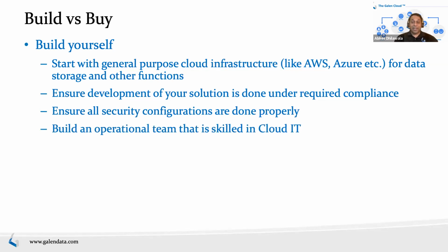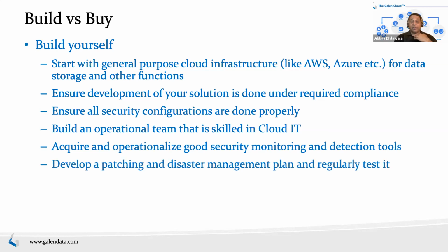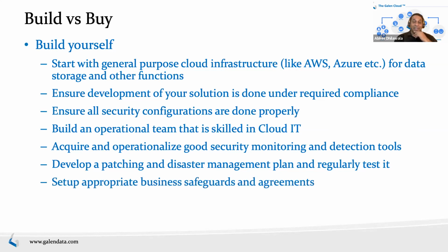Build a team that's skilled in cloud IT, and acquire tools, specifically good monitoring and detection tools. Develop a disaster management plan, and importantly, test it regularly, and then obviously set up all the right safeguards agreements that we just talked about.